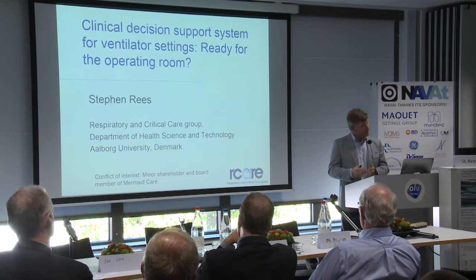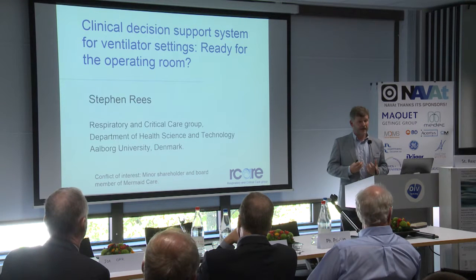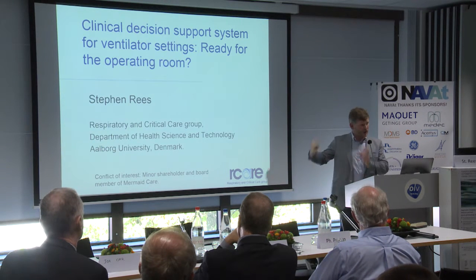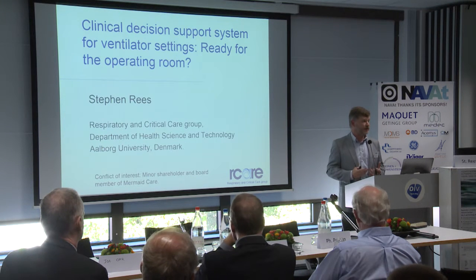There are commercial systems. The Draeger SmartCare has now moved over into the operating room, so they are clearly ready to move forward. My own take is I'd like to see us bring more of the physiological understanding that has existed since the 1960s and 70s, well mathematically formulated, into our bedside care using mathematical calculations that we simply can't do in our head.